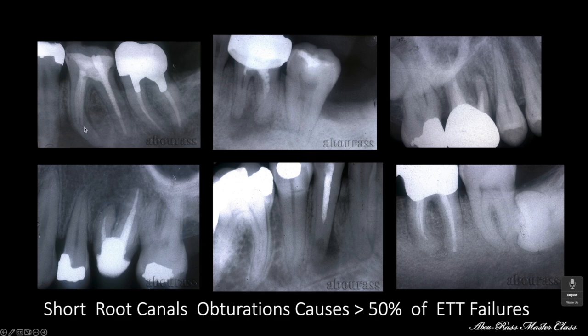And here you can see, because of the calcification and the curvature, we had a ledge in the hands of the clinician. Then we had pathology. Because you remember I mentioned in my presentation on the management of upper anteriors and mandibular anteriors that the apical third almost always has remaining canal. It's patent because the pulp died and no longer can close. So you have basically a dead space.